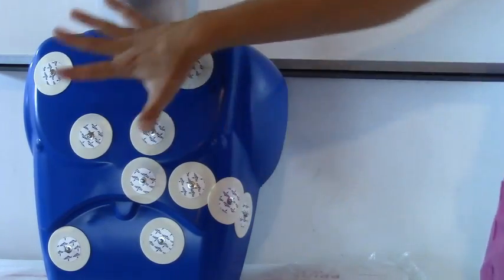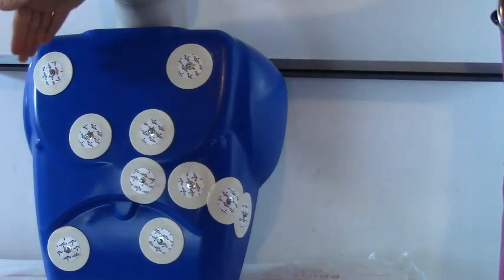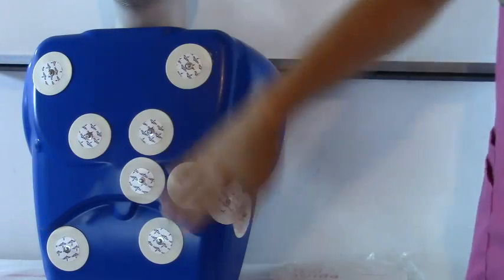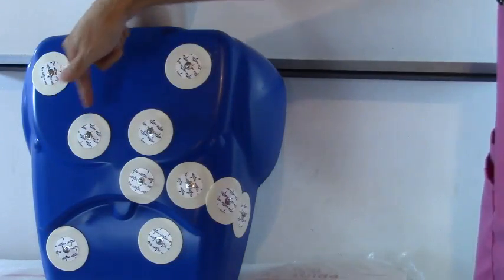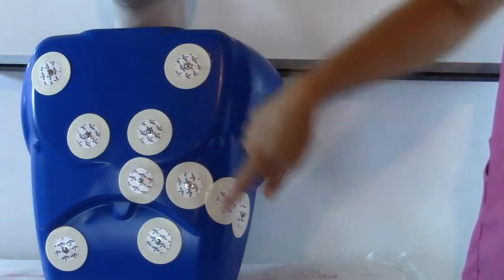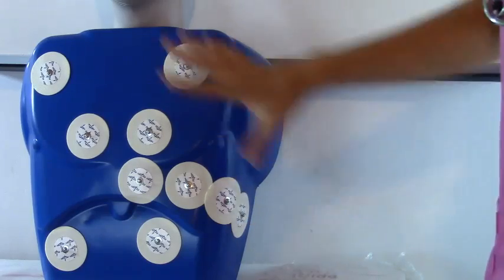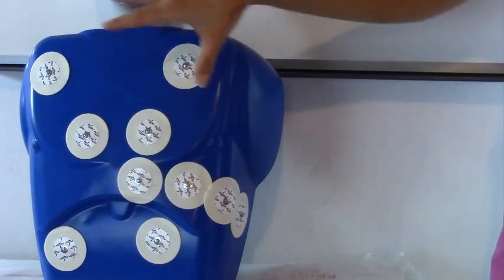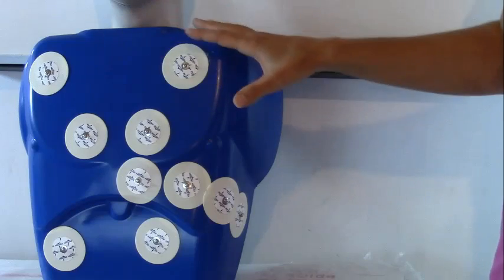Okay and now you are done you have your right arm left arm right leg left leg you have V1 V2 V3 V4 V5 and V6 so that is how you place electrodes for a 12 lead EKG.